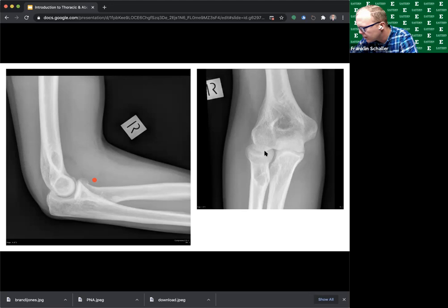And I'm not surprised because clinically, the patient's hitting all the bells and whistles, especially that lack of extending the elbow all the way out. Great pickup.